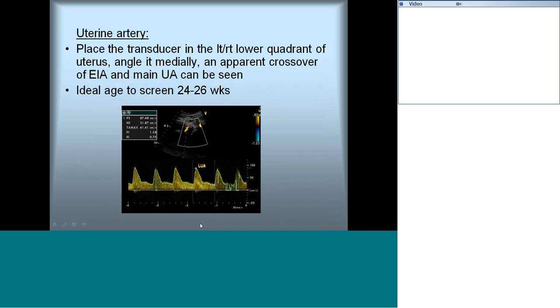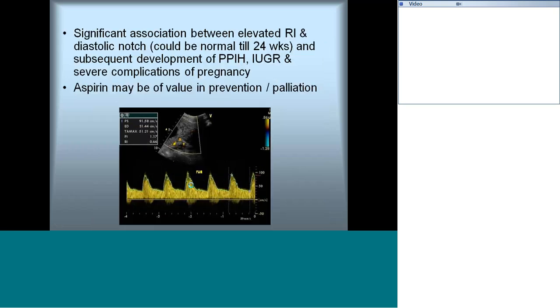The last Doppler study is the uterine artery, obtained at the right and left iliac fossa — it runs perpendicular to the external iliac artery. With the probe parallel to the inguinal ligament over the iliac fossa, the uterine artery is visible. The ideal age to screen is 24 to 26 weeks and both sides should be screened separately. Normal flow shows systolic and continuous diastolic flow. A diastolic notch — a dip during diastole — indicates increased resistance index in the uterine artery and suggests the baby may develop IUGR or severe complications of pregnancy.